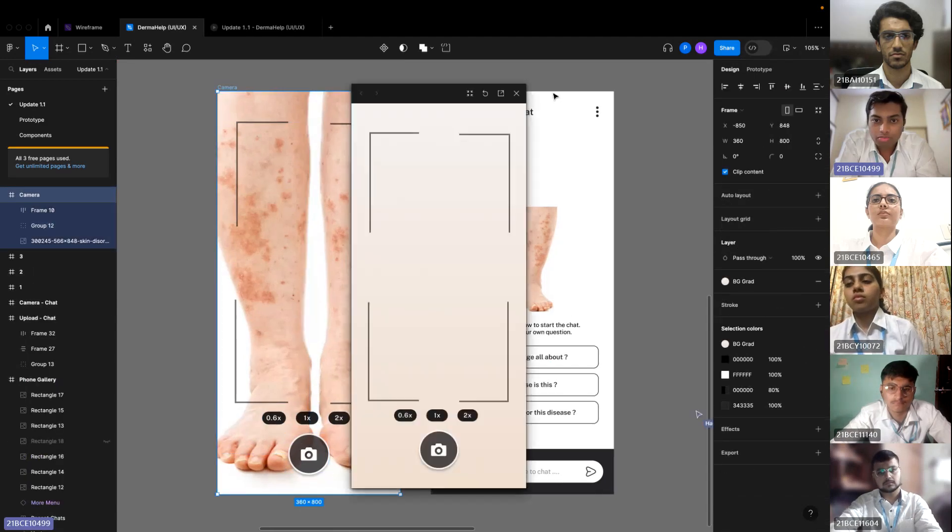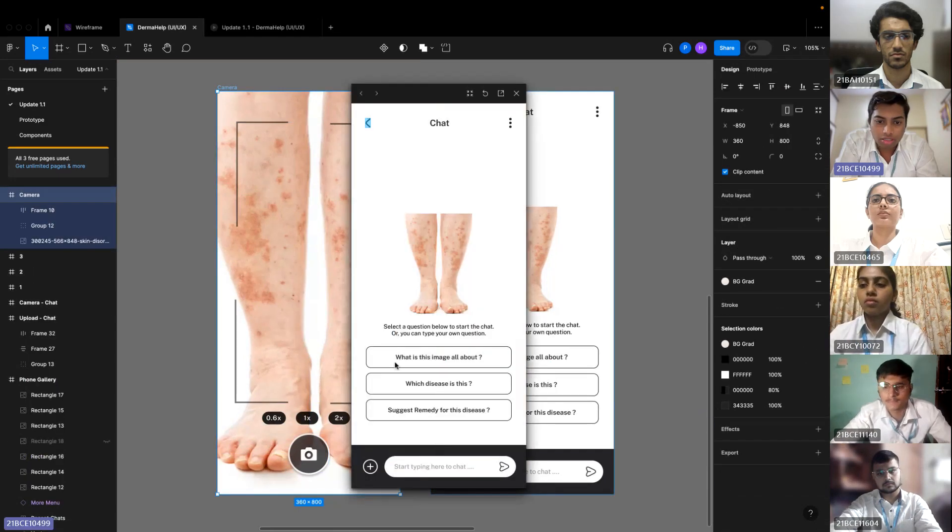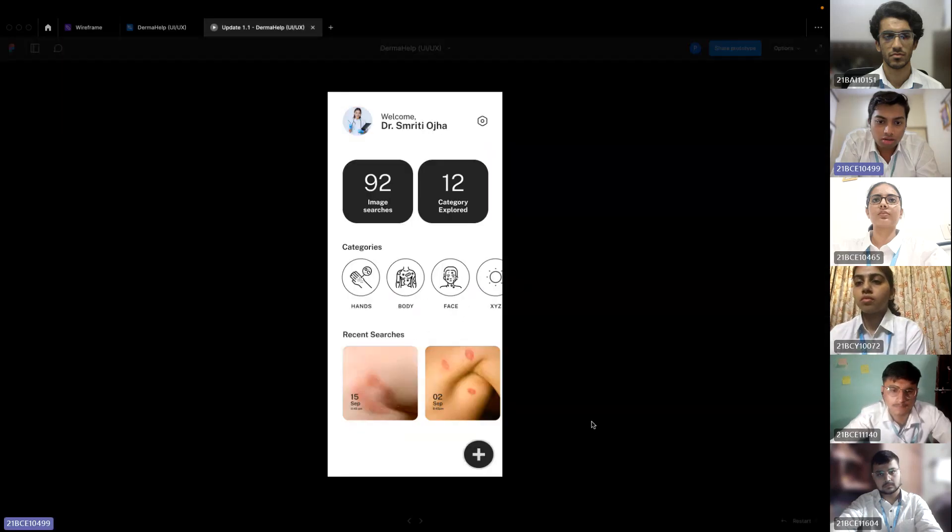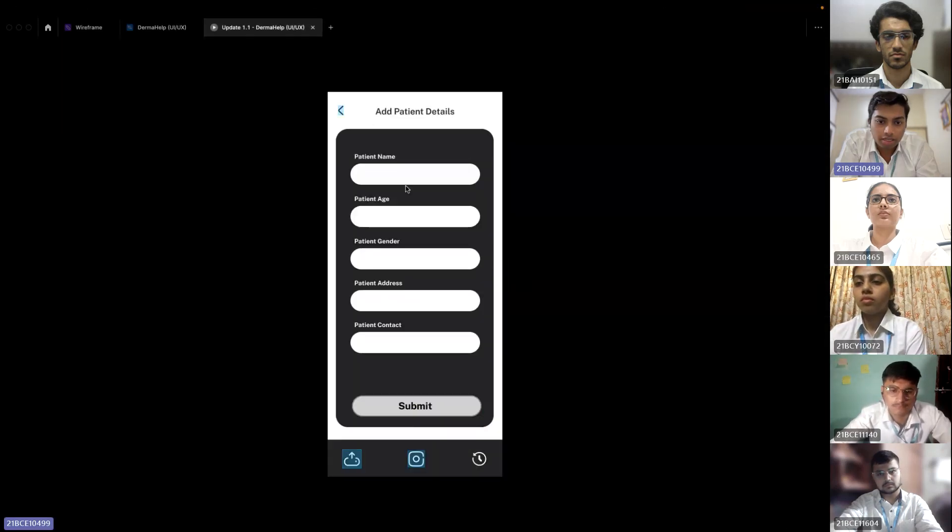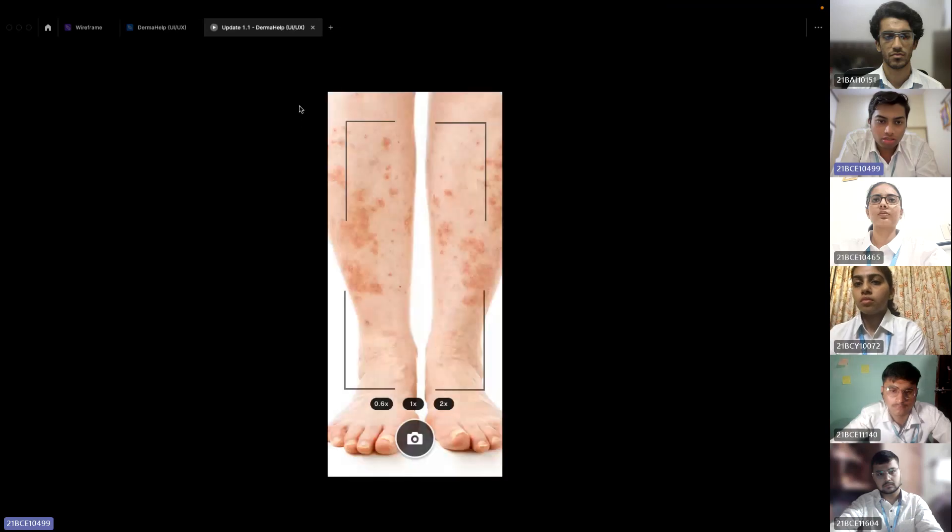This is the page of how the camera UI is. Let me show you a prototype. Here we take a picture and this is where we can chat. This is our landing page. We click on the floating button. We can add details or click on the picture.